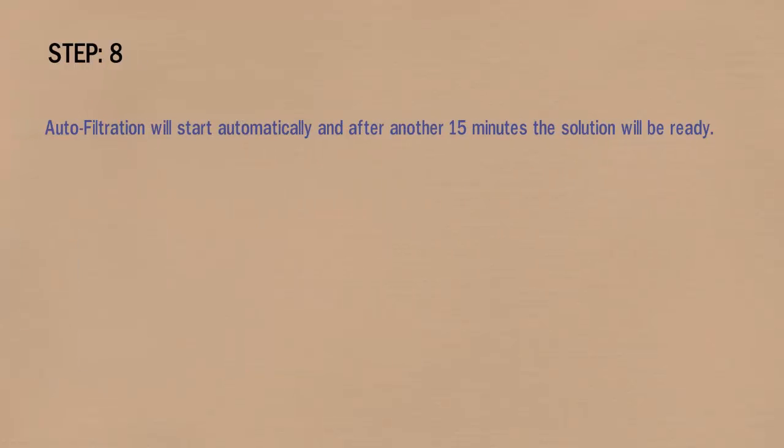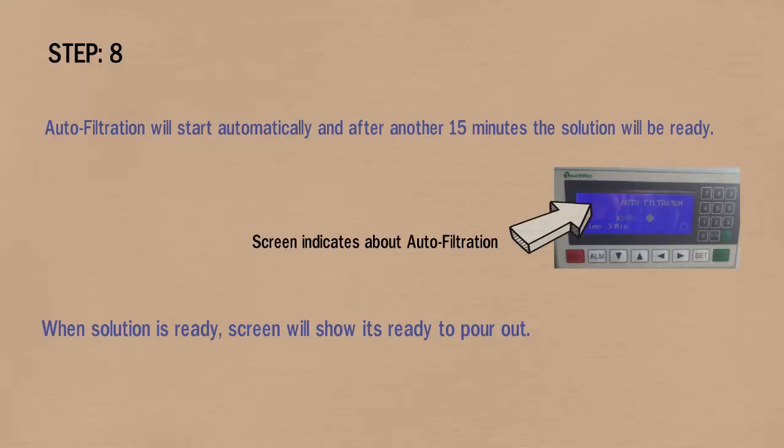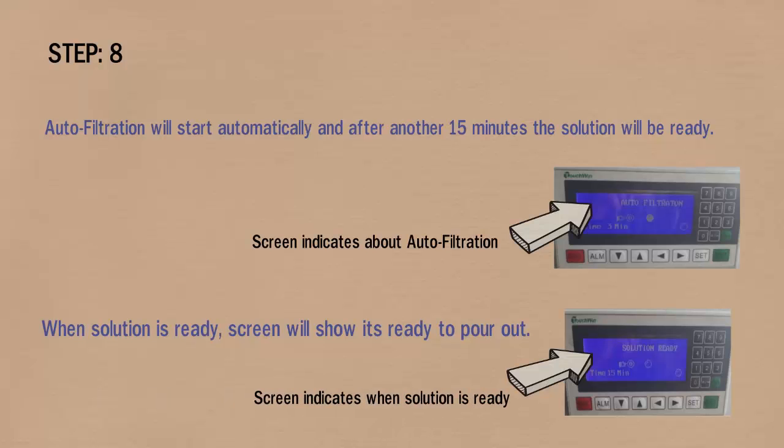In step 8, auto filtration will start automatically, and after another 15 minutes the solution will be ready. The screen will indicate about auto filtration, and when the solution is ready the screen will show it's ready to pour out.